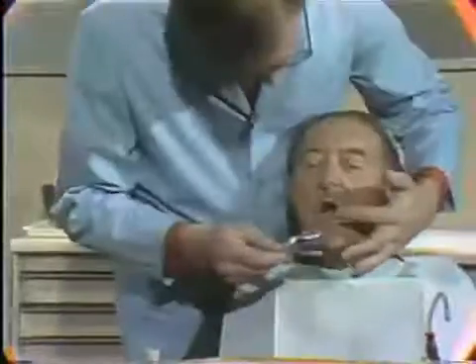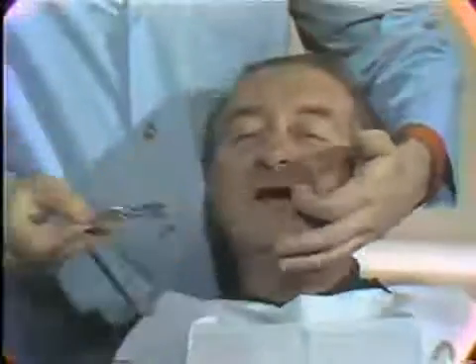The tray selected is always tried in the mouth to ensure adequate clearance on the peripheries and to determine where modifications may be needed in red utility wax. The maxillary tray is being modified in the post-dam area with red rope utility wax.